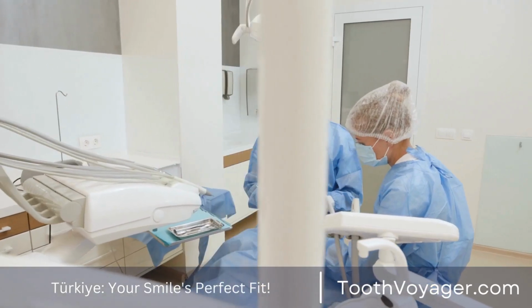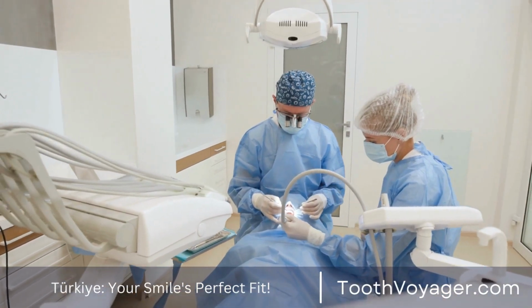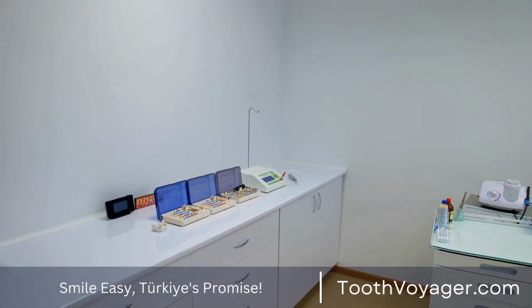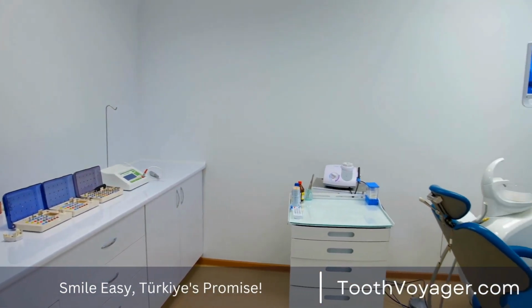Dental technicians make use of the wax model to make the final prosthetic teeth, making sure they are in line with the dimensions, shape, and shade of the teeth that are natural to the patient. The dental prosthetics are fixed to a foundation designed to suit the mouth of the patient.